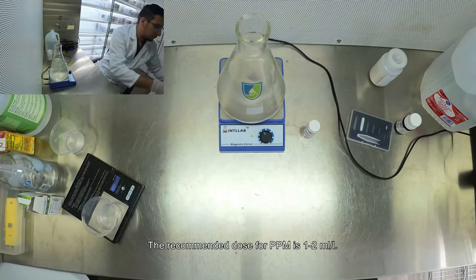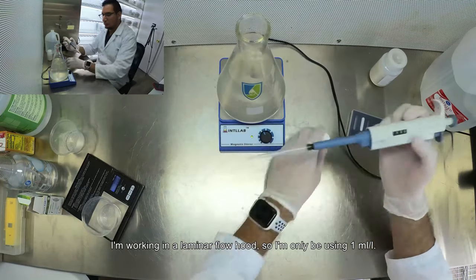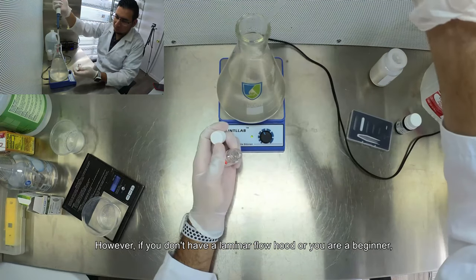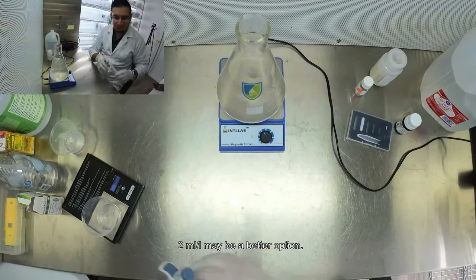The recommended dose for PPM is one to two milliliters per liter. I'm working in a laminar flow hood so I'm only going to be using one milliliter per liter. However, if you don't have a laminar flow hood or you are a beginner, two milliliters per liter may be a better option.